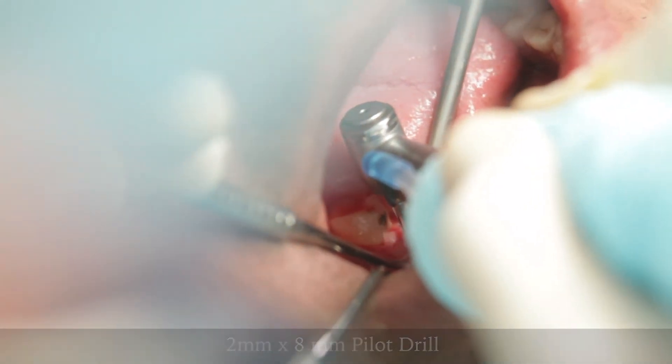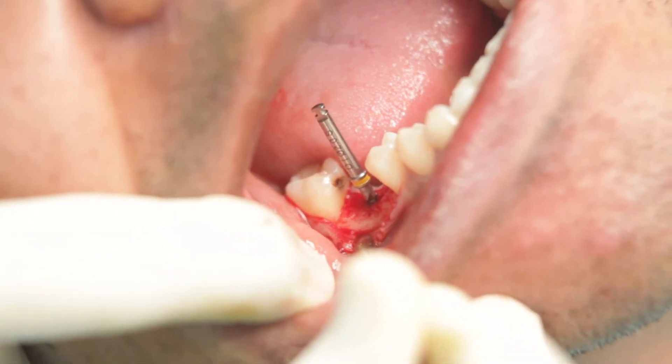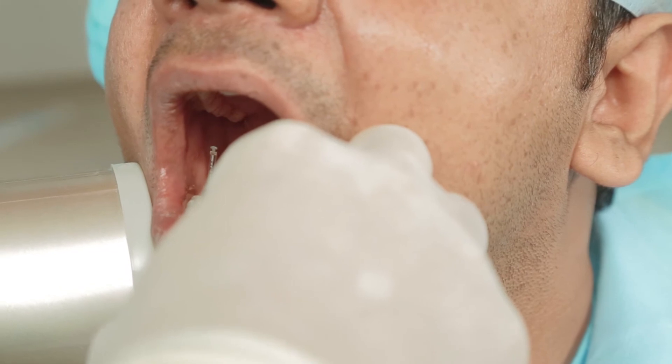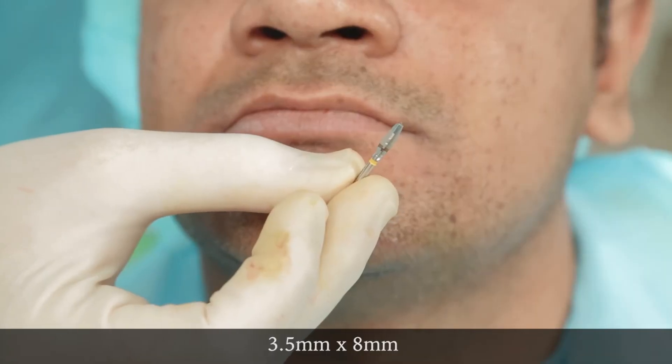Because I had an estimated length of 8 mm, I will use it until I reach the 8 mm mark. Following this, I will take an IOPA just to confirm that I am at a safe distance from the nerve. Everything seems to be fine, so I can now go ahead with my successive drills in sequence.